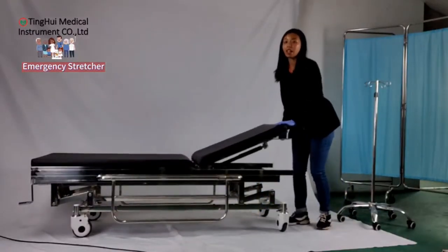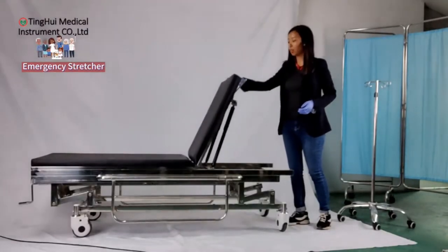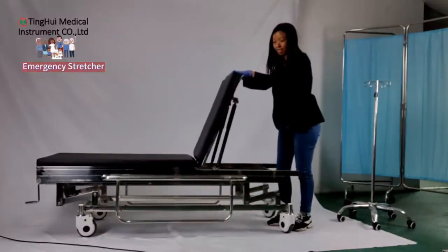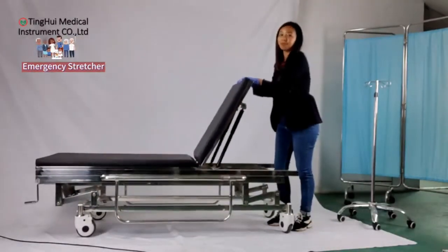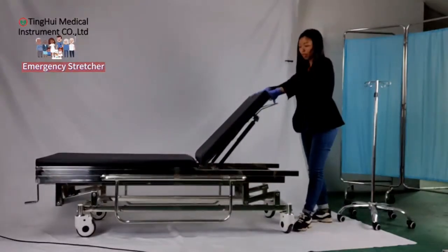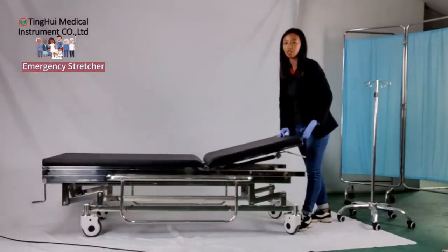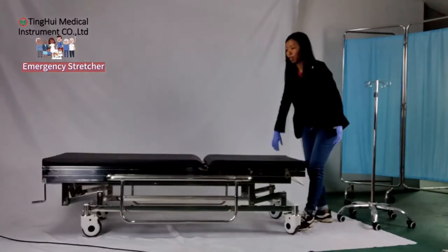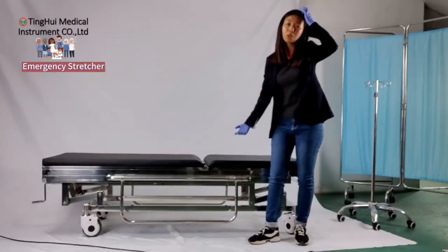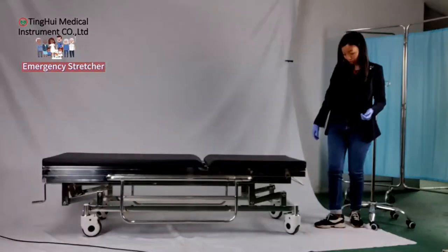Besides that, it also allows you to arrange the backrest in any area you want. It is very easy — you don't have to use any hardware. After that, it also allows you to transfer the patient to the surgery room.